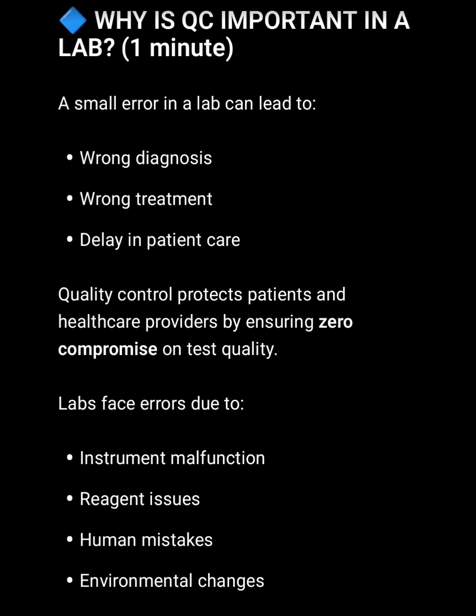Why is QC important in a lab? A small error in a lab can lead to wrong diagnosis, wrong treatment, and delay in patient care. Quality control protects patients and healthcare providers by ensuring zero compromise on test quality. Labs face errors due to instrument malfunction, reagent issues, human mistakes, and environmental changes.